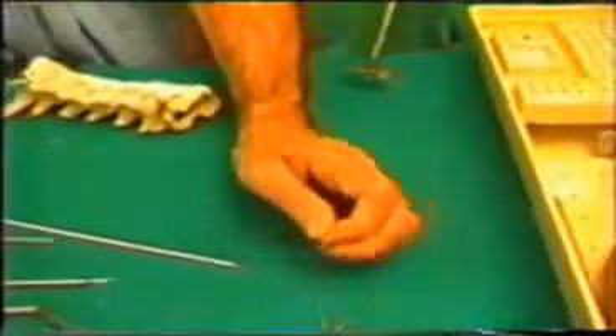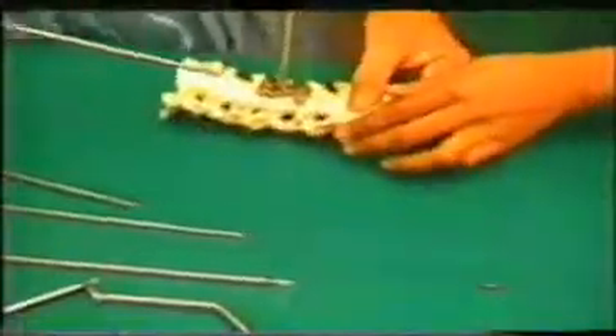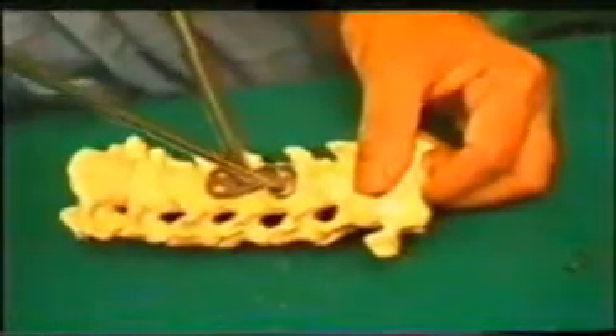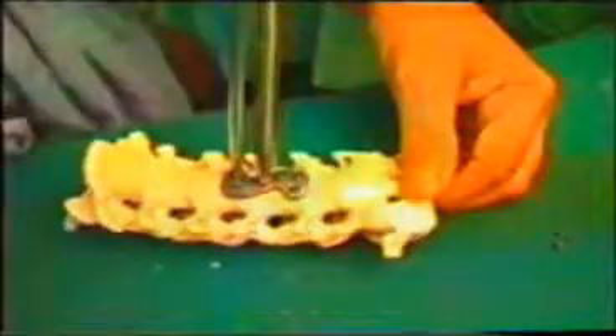These are the screws. This is the holder for the screw, which holds the screw tightly. You fix each screw in position — the second, the third, and the fourth. All four screws are placed at an angle of 15 degrees.